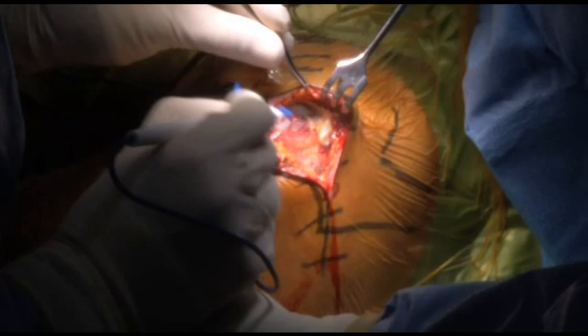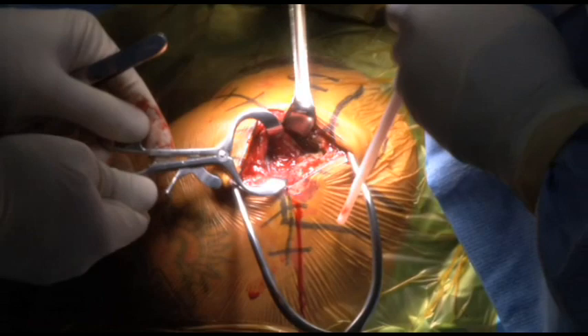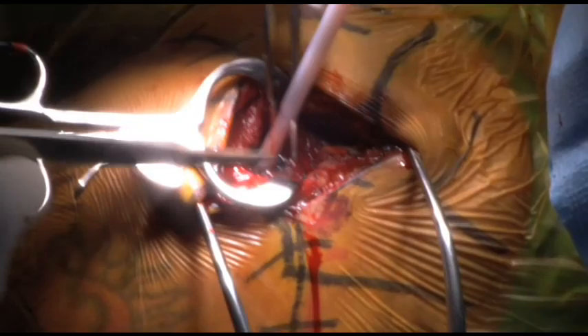We're going to raise skin flaps and make a longitudinal split. We're going to release the deltoid fibers. There's good soft tissue here. We're going to excise a little bit of the bursa to get visualization. Our first goal is to find the greater tuberosity — and now I've found the fracture site right here. This is the greater tuberosity right here.